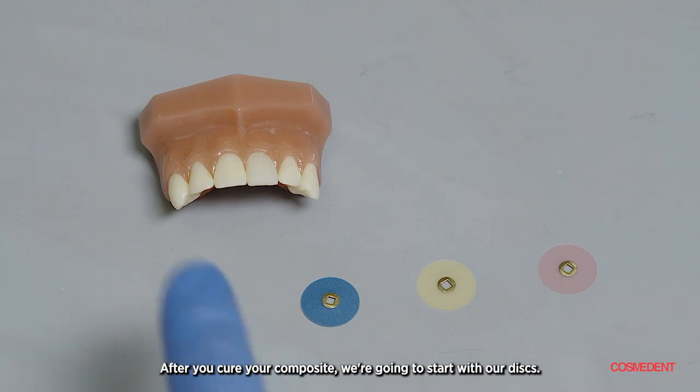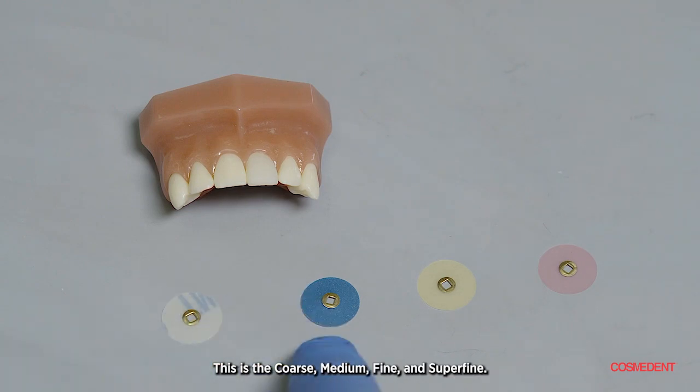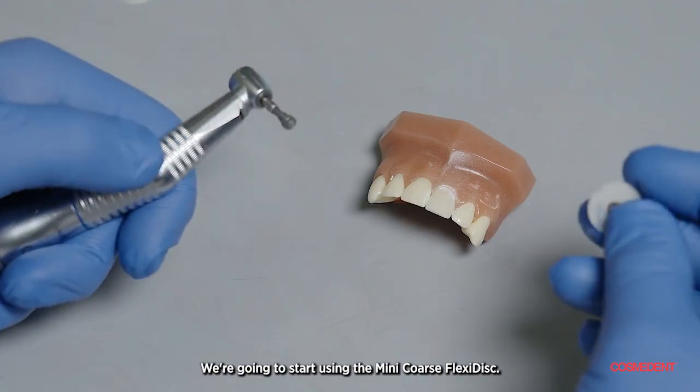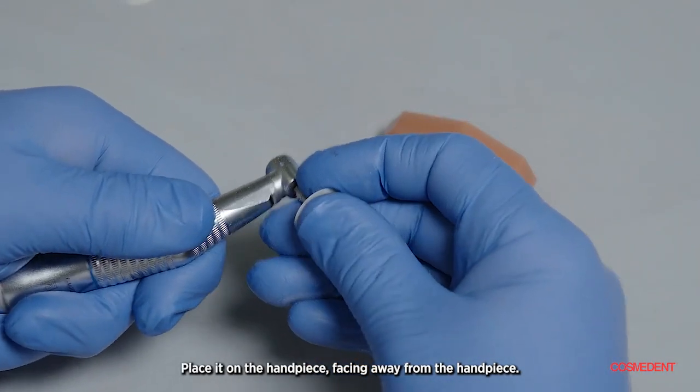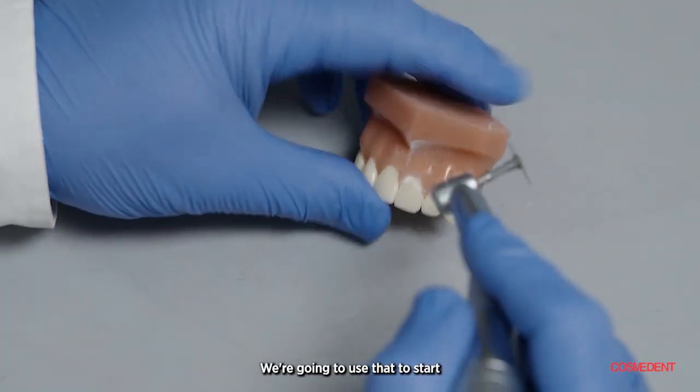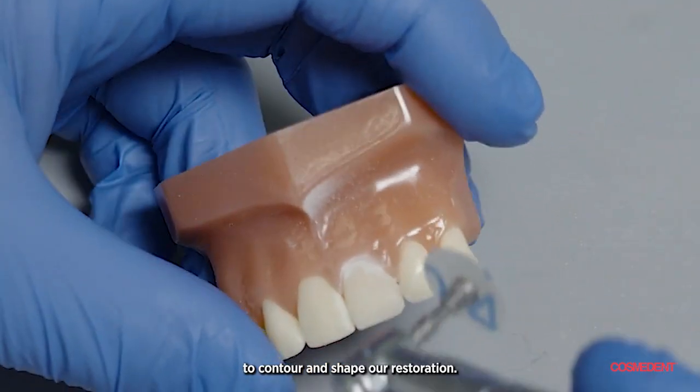After you cure your composite, we're going to start with our discs. This is the coarse, medium, fine, and superfine — all color coordinated, so whatever you use will go with it. We're going to start using the Mini Coarse FlexiDisc. Place it on the handpiece facing away from the handpiece. We're going to use that to start to contour and shape our restoration.